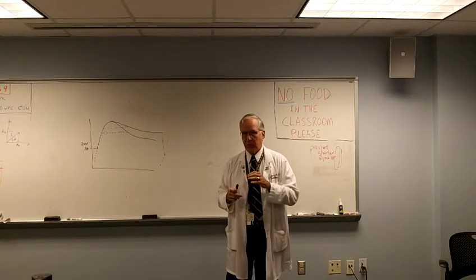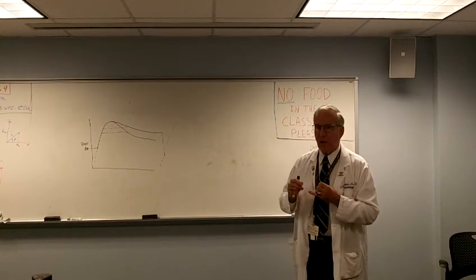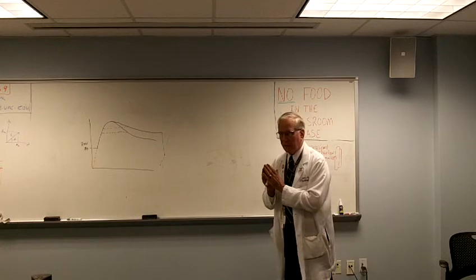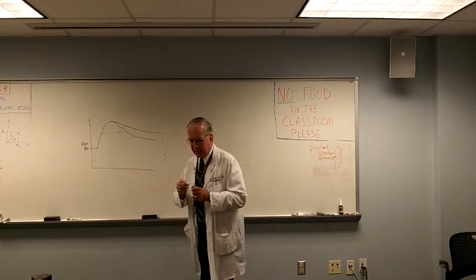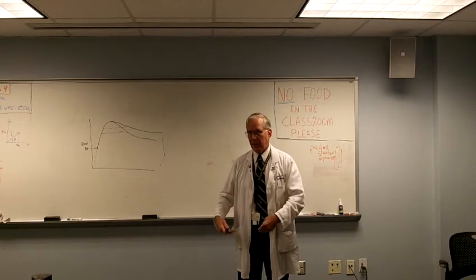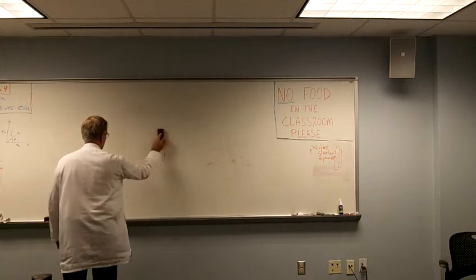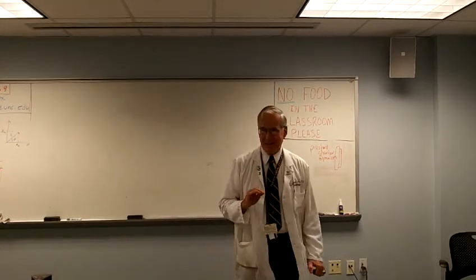So you've done two very important things. You have decreased the oxygen demand on the left ventricle by lowering the pressure at which the left ventricle has to contract against to eject the blood from the ventricle into the aortic root, and you have effectively raised the diastolic pressure by decreasing diastolic runoff to the abdominal viscera and the lower extremities, so you increase coronary artery perfusion. That's what it's designed to do. Does that make sense? Did anybody follow what I was just saying? Yes, sir. Okay.